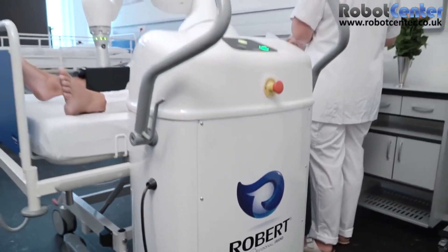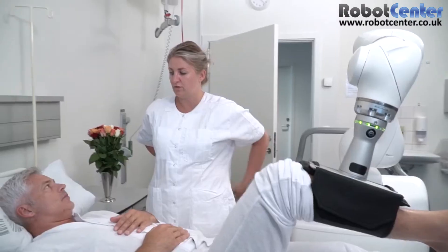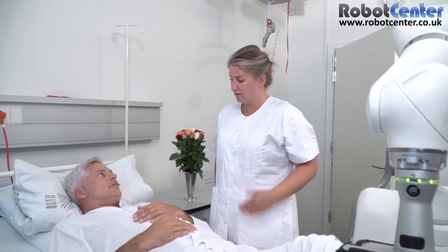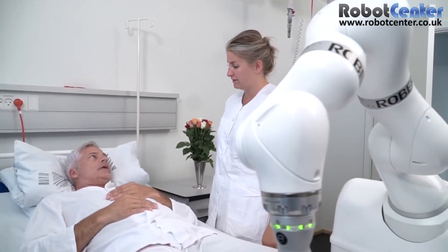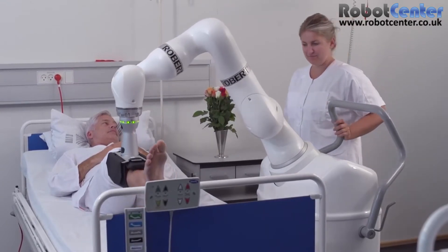Such time could, for instance, be spent talking to the patient or carrying out other patient-related work in the ward room. Moreover, the physical strain on the therapist will be reduced and thus the risk of work-related muscular pain will be significantly minimized. And all the while, the patient will receive optimal physical training.